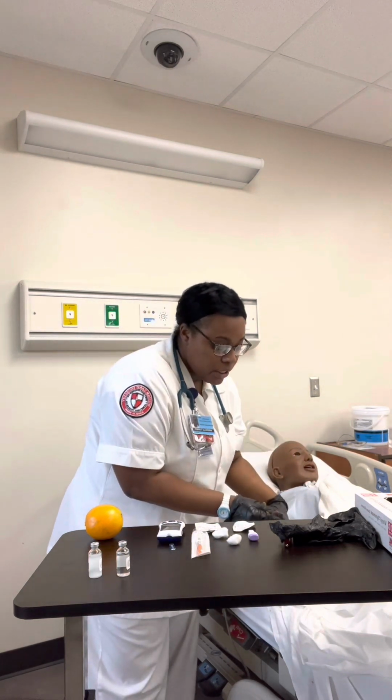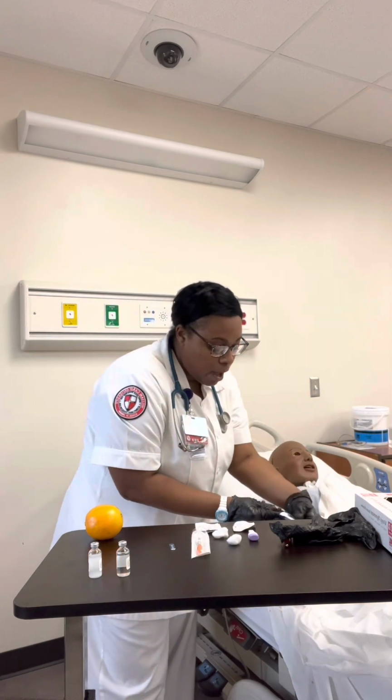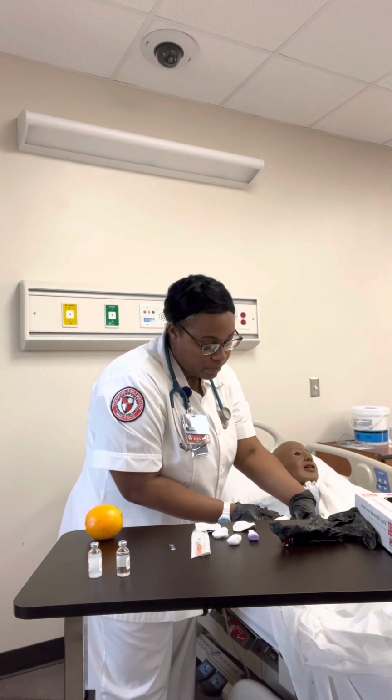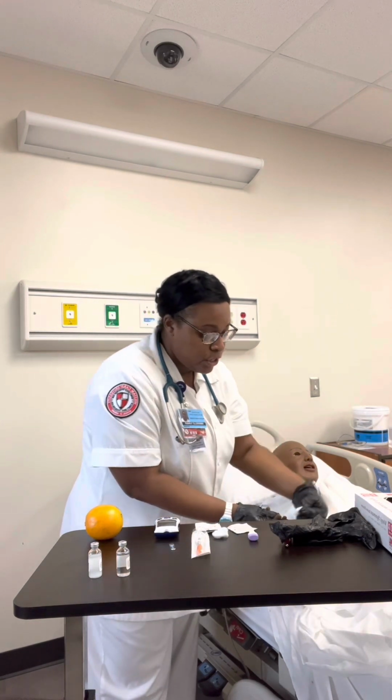I'm then going to gently squeeze the finger, place the glucometer at the tip of the finger, and allow the blood to wick to the test strip. The patient's results should display on the screen. At this time, the patient's blood glucose is 252.